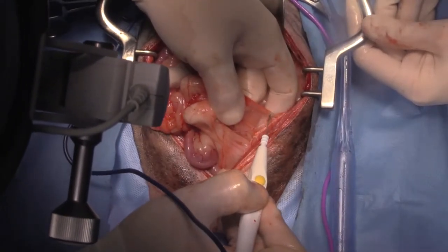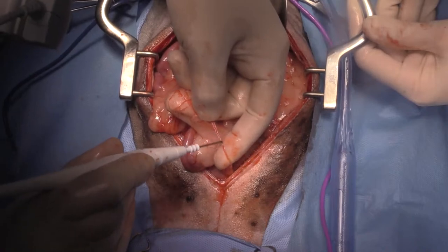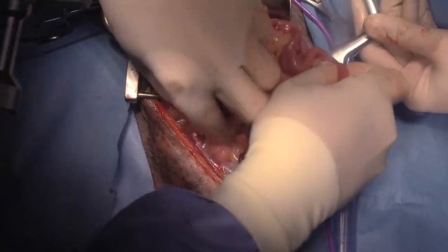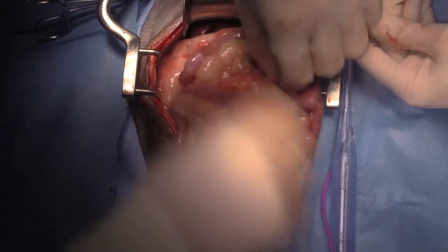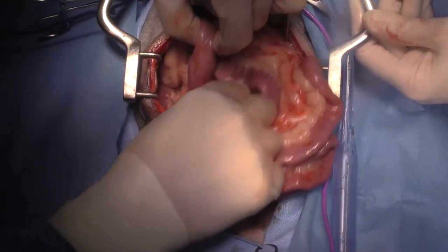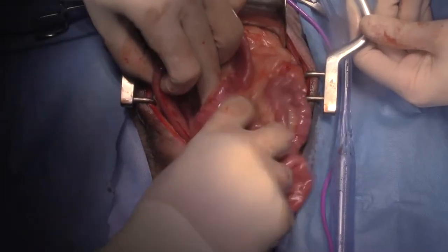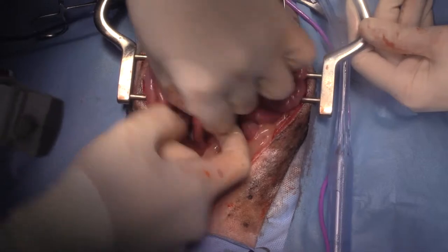A couple of omental adhesions to the space, which we'll just take down. So just taking down a couple of adhesions in here from when the animal was desexed as a puppy. So got the colon there. So duodenum, I'm just trying to follow this around past the duodenal flexure. Bring it back down there now. Come around into the jejunum.